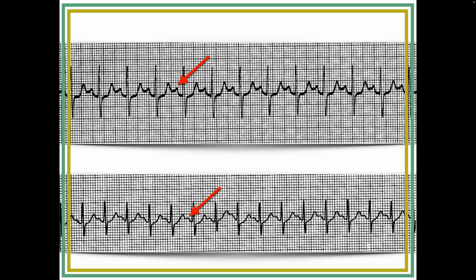There's no particular reason. The thing is, if you wanted to be very precise about the PR interval, which in our case we don't need precision, we just need to know whether it's between 3 and 5 small boxes. But suppose you did want to know the exact measurement of the PR interval, you'd actually have to draw the line down till it hit the isoelectric line. If you wanted to be that precise. For our purposes, that doesn't matter. But I'm just mentioning that so you understand what you're seeing.